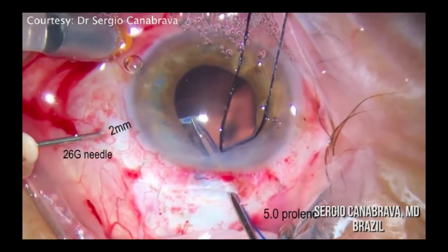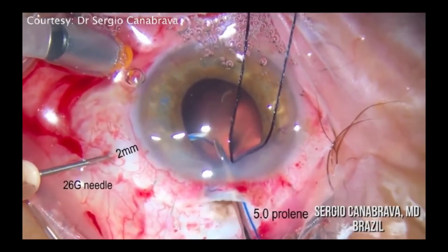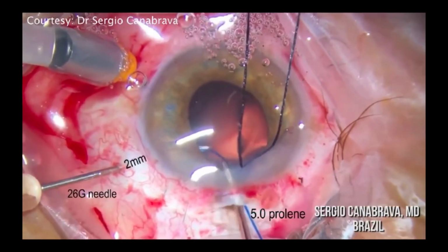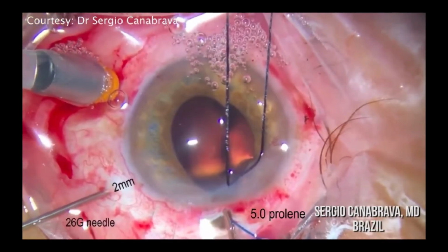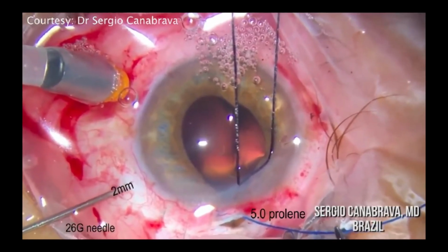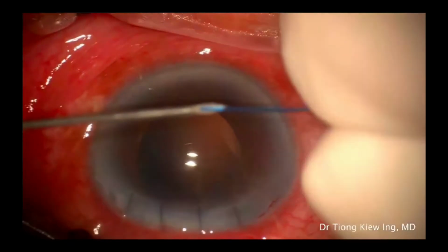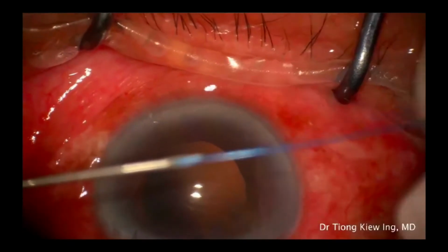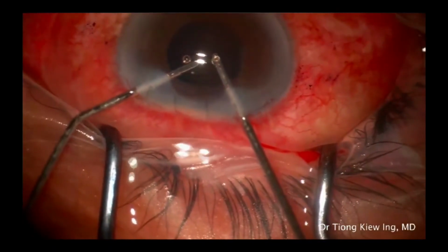In this video, I'm demonstrating some simple modification to ease the process of 4-flange sclera fixation technique. In the original 4-flange sclera fixation technique, the sclerotomy measure 2 mm from the limbus is performed. Then the Prolene suture is inserted into the 26-gauge needle with the help of the microforceps. In my case, I am demonstrating preloaded Prolene 5/0 suture into the 27-gauge needle. The same procedure is repeated on the other side.